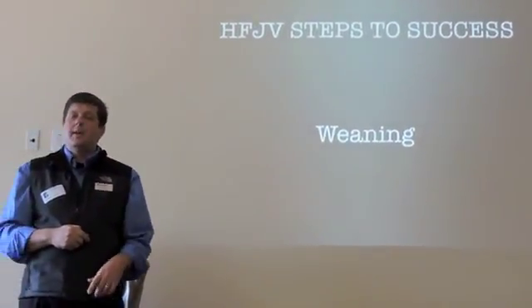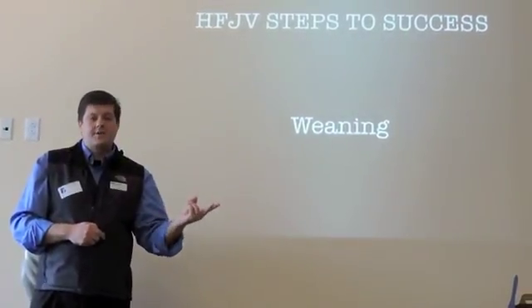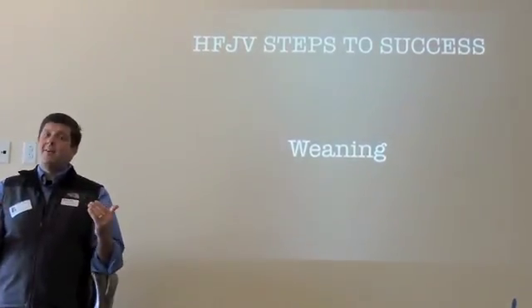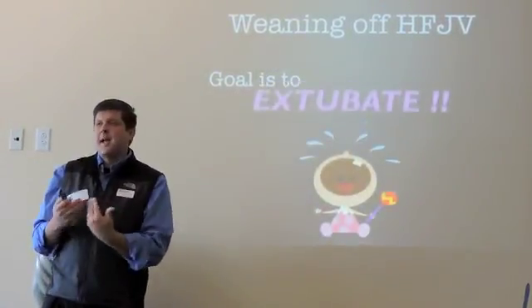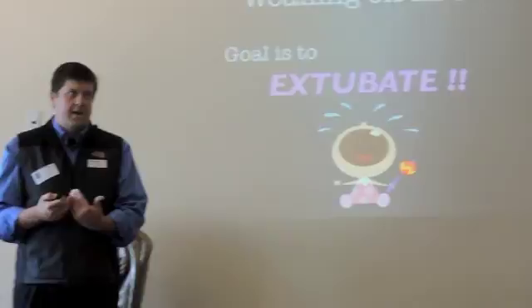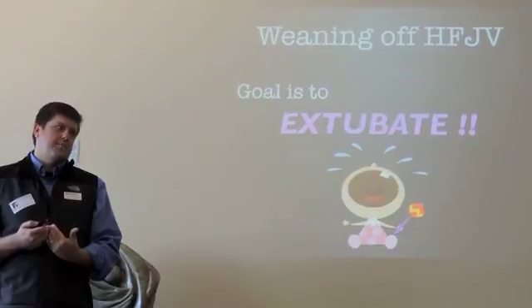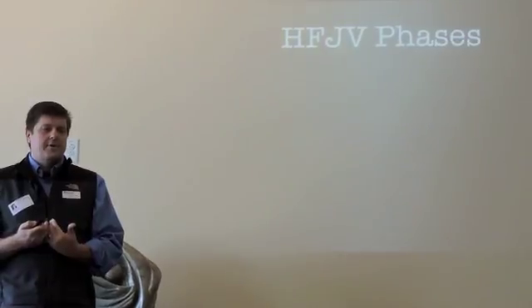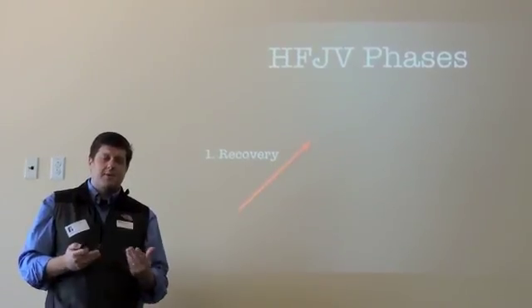So the last section here is weaning. We've talked about the jet, we've talked about the conventional ventilator, all about oxygenation, how it all gels together. Now we come to the part that's more art than science, the weaning. Remember, your goal with your patient is to extubate and send them home with mom and dad. Our goal isn't to get them off high frequency. High frequency, both jets and oscillators, is the most gentle kind of positive pressure ventilation that we get, intubated. I've never understood why we're so quick to take them off of high frequency when we can just extubate straight to nasal CPAP, because that's pretty much all it is.